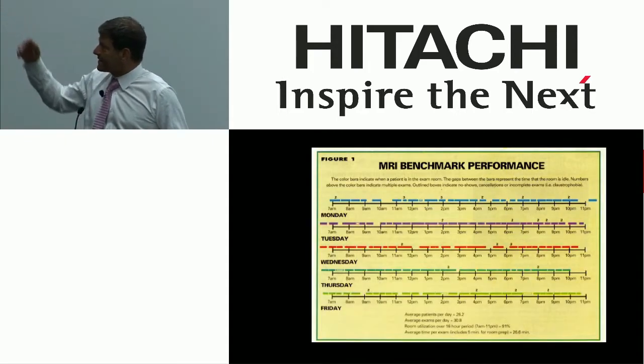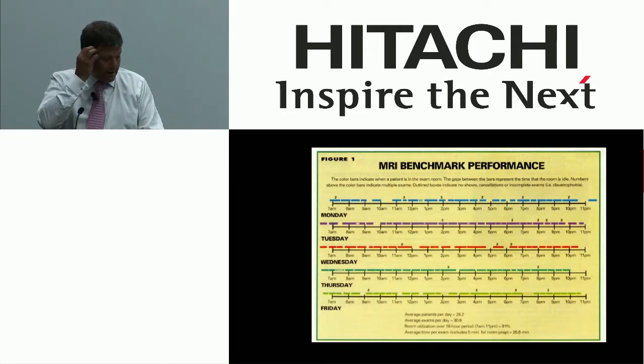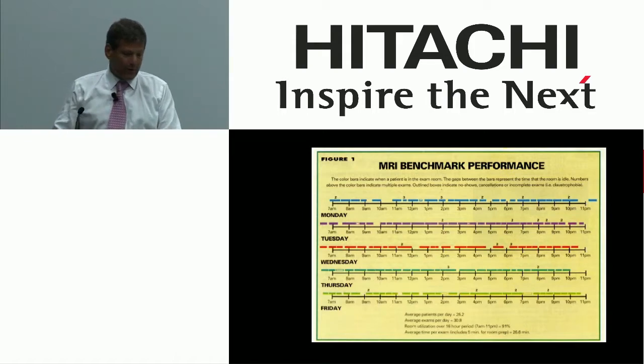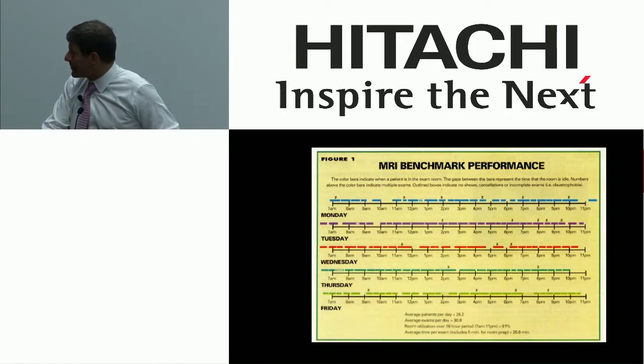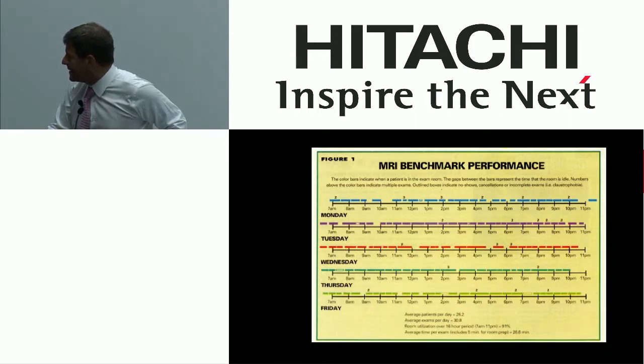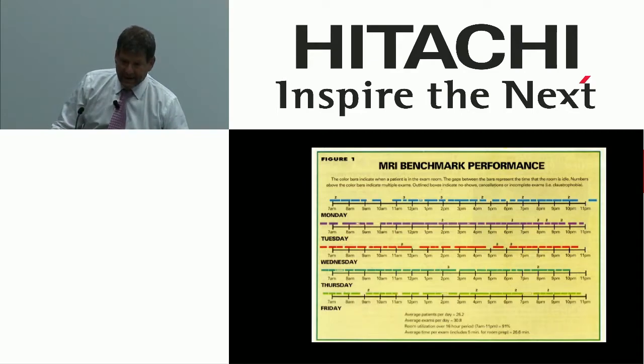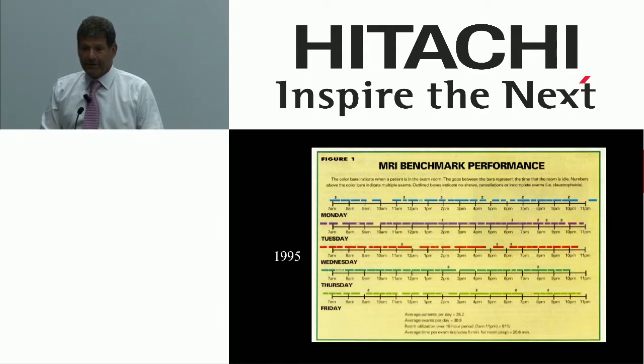I mean, this is kind of the goal, right? This is actually a day-to-day flow sheet from a scanner, a 1.5T closed bore, 60 centimeter bore scanner that I used to operate. If I can see from here, it was running about 26 patients a day, about 31 exams per day. It's not bad, right? The only thing that makes this scanner remarkable is it doesn't benefit from any of the bells and whistles we have today. This is from 1995, okay?